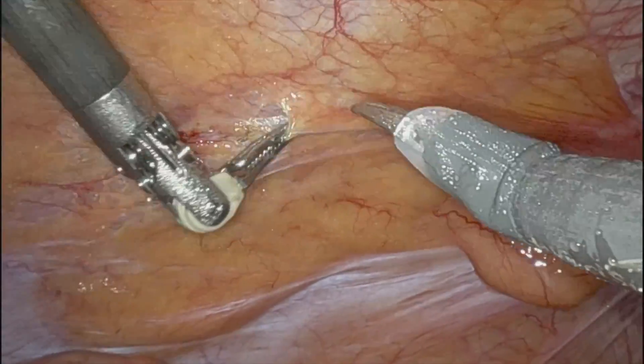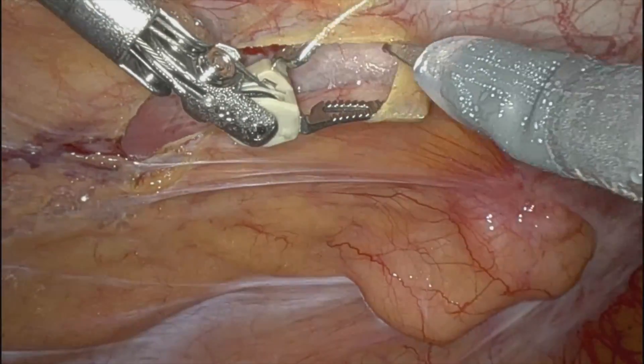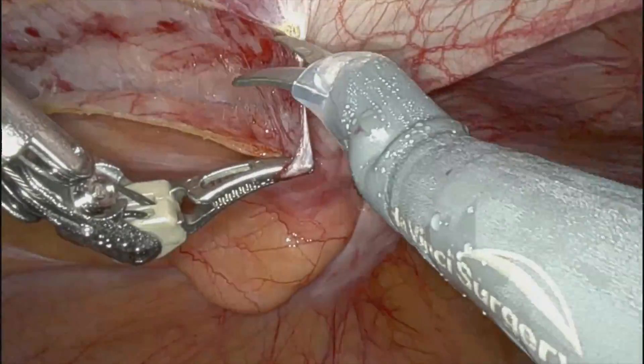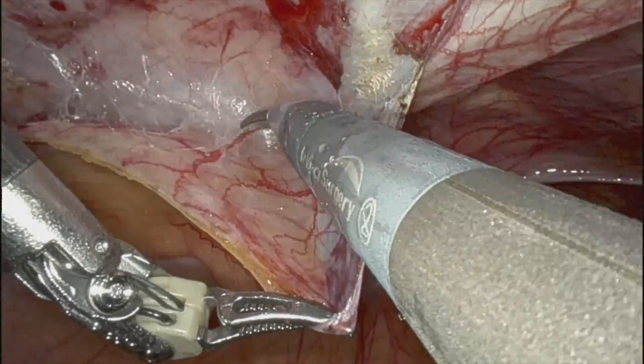I treat it a little bit higher with my dissection plane. But again, I stay in the preperitoneal pocket. There across that spot is the arcuate line. So I try to go just above the arcuate line, and then I do my crossover. I'll try to pull the preperitoneal pocket down where I'm sort of connecting the dots.